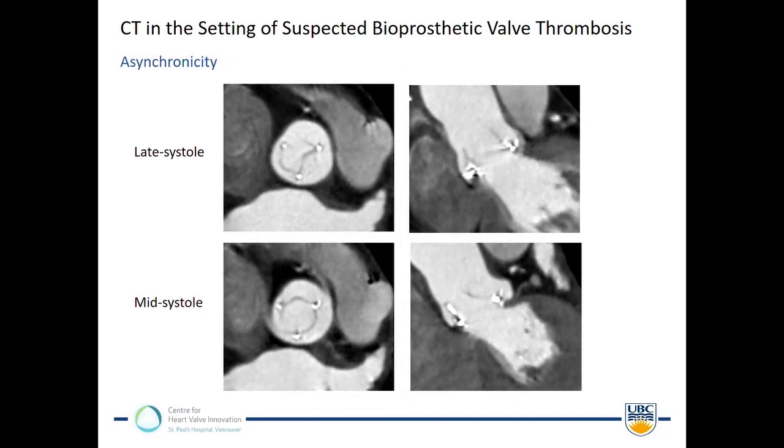We have been asked by multiple vendors, when we did the core-lab reads, to also grade restriction. I would never, ever mention the word leaflet restriction in a report if there's not concomitant thickening, simply because CT lacks the appropriate temporal resolution.